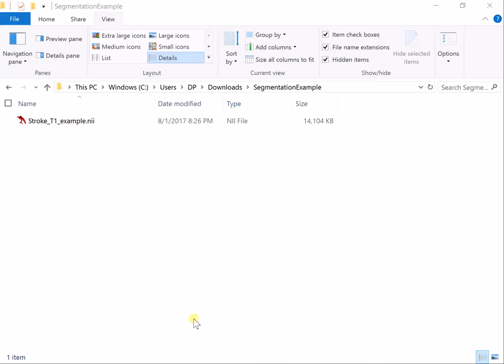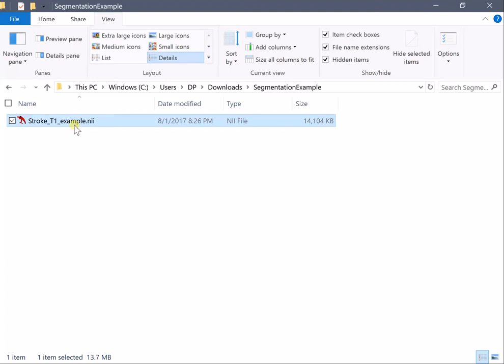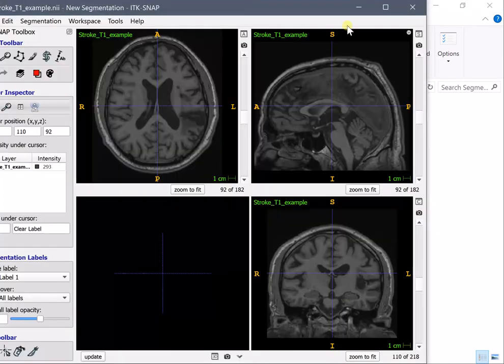In this video I will show how to perform fast manual lesion segmentation using ITK-SNAP. What you see here is a simple nifty file from a patient with stroke.